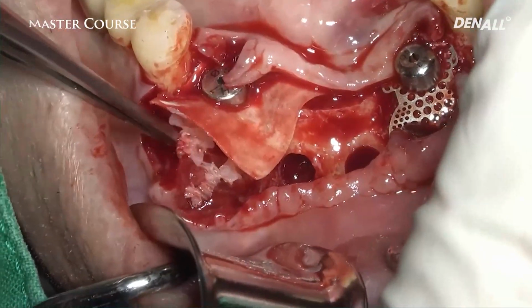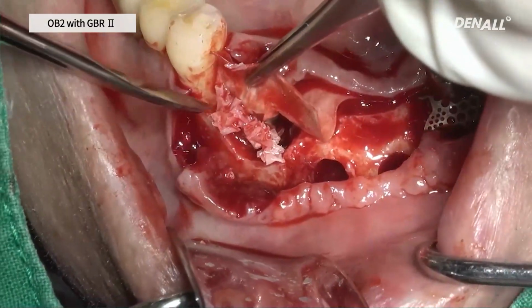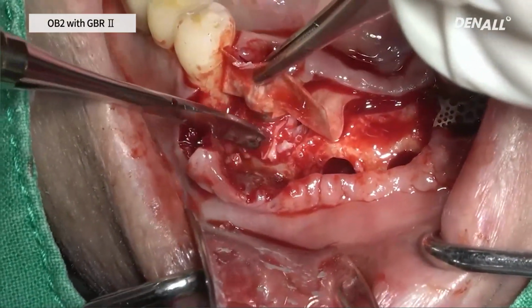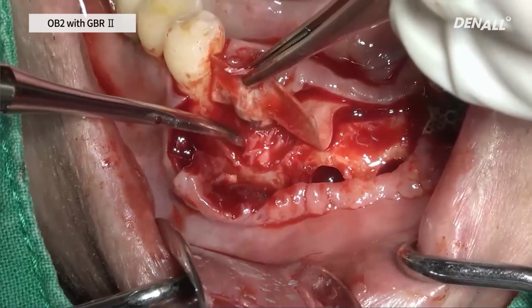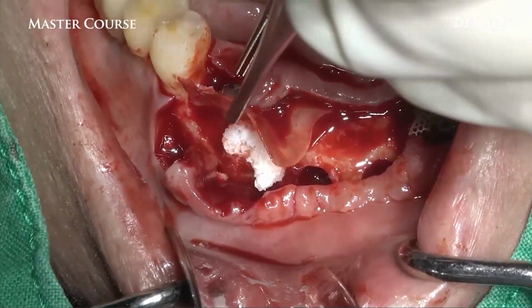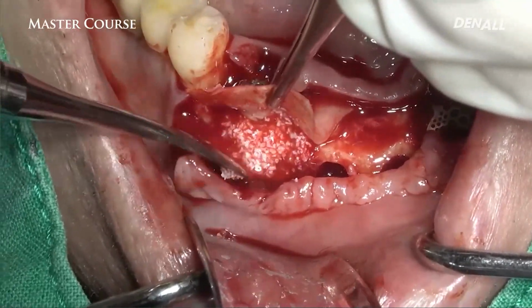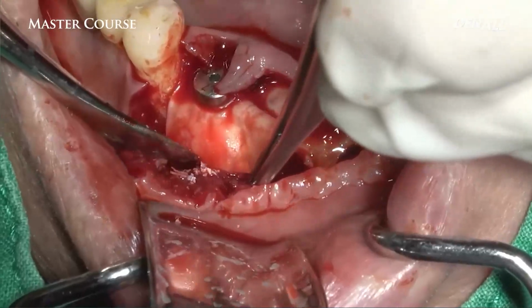Membrane is lifted. Around the implant body, I'm going to use the autogenous bone that I've harvested using autobone collector, and then on top, I'm going to use a xenograft. I'm going to cover the bone graft using the membrane.